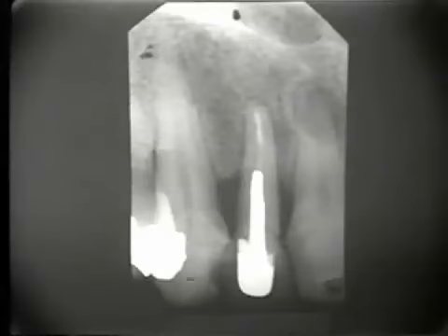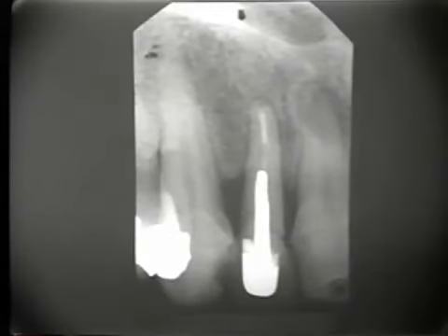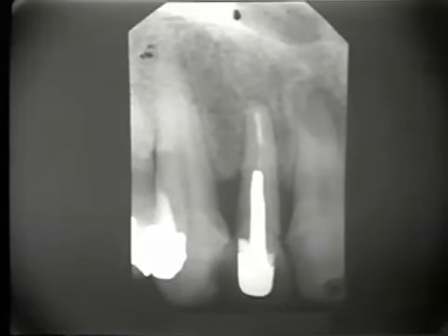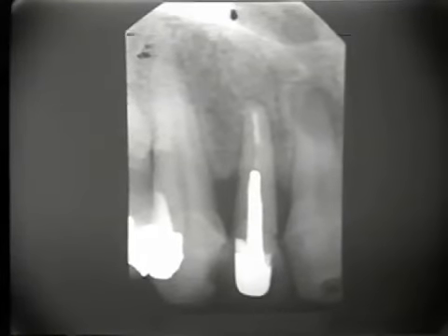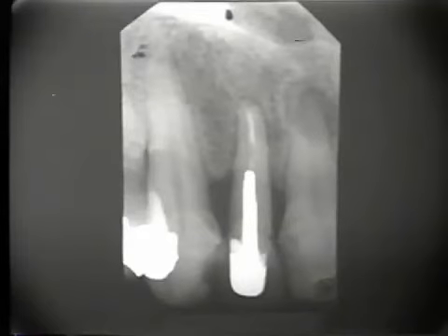The next exposure is made of the maxillary right lateral. And we endeavor to place it somewhat toward the center of the film, and we will choose the horizontal angulation so that we will open the mesial contact between the lateral and the central, thus affording us a view of the distal side of the central, which we may have missed previously. The distal side of the lateral may overlap with the cuspid, but that contact will be opened on the next radiograph.